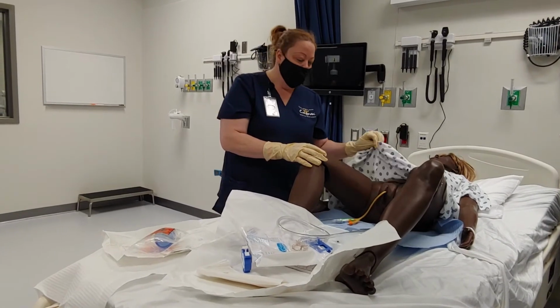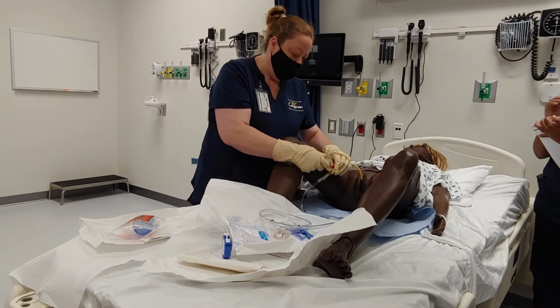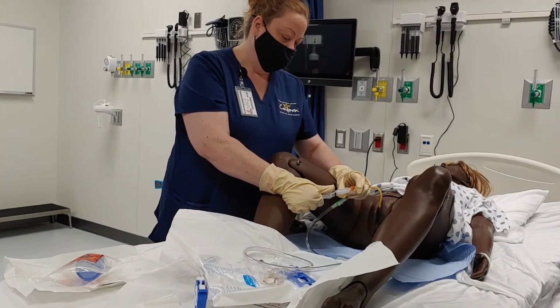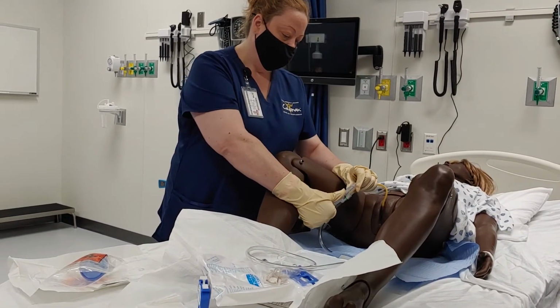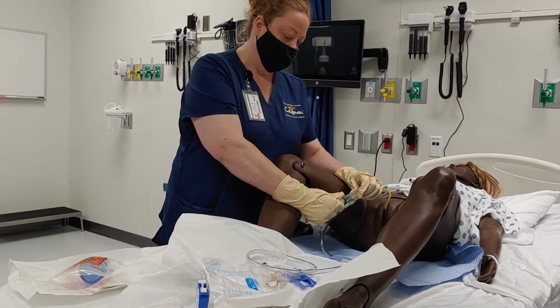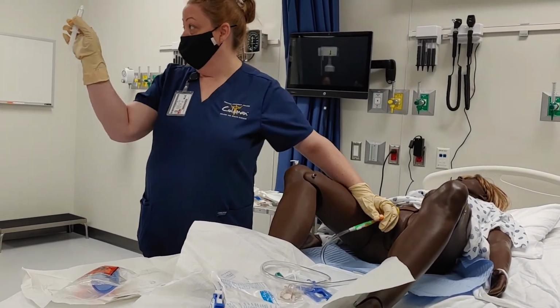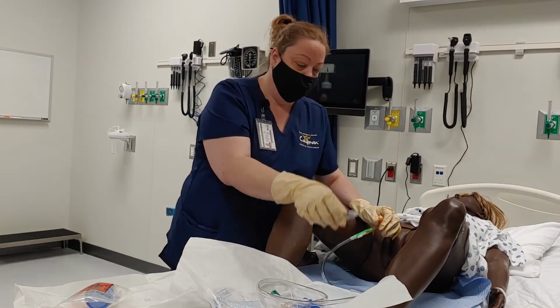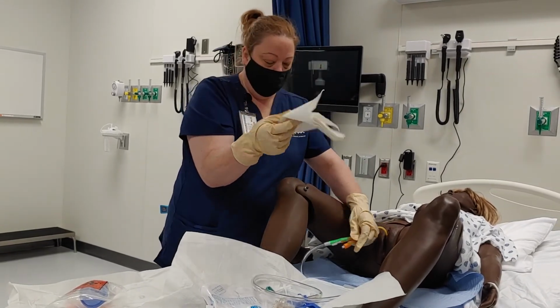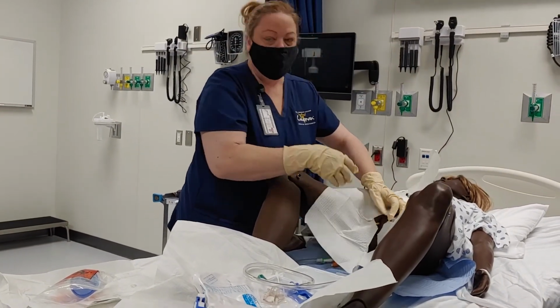All right? Now, if we were doing a straight cath, and I'm just going to show you one thing real quick. Let's go ahead and take this back out. If we were removing it, first thing we do, take out the fluid that's made that little balloon in there, okay? And then we would want to have some type of absorbent pad. I didn't show you guys this one because it was too hard to go through it, but this is the fenestrated drape here that we can put on there to separate it and everything.